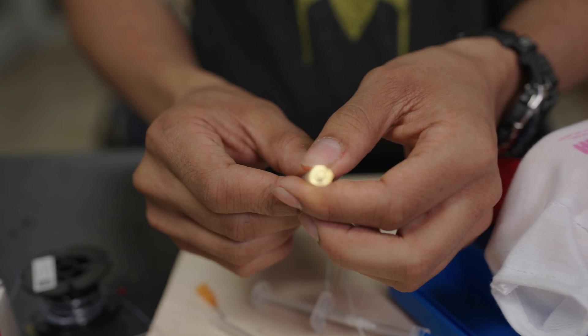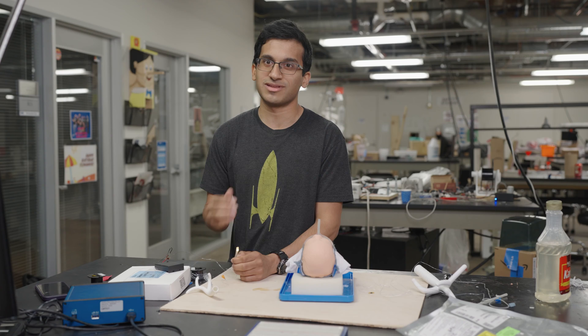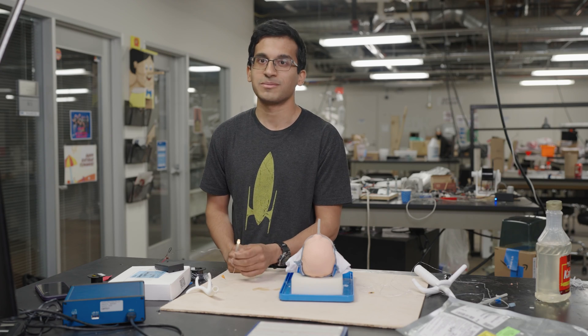While the physician is intubating, they'll have a clearer view of the trachea and the tracheal anatomy until they get to a point called the carina, where they can stop. Getting all the components super small and in the right place was one of our biggest innovations here.